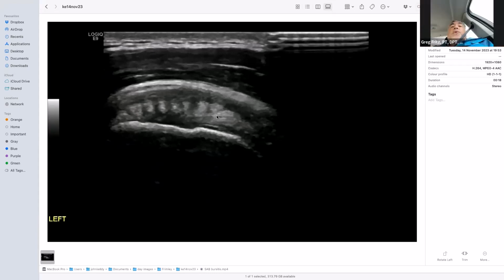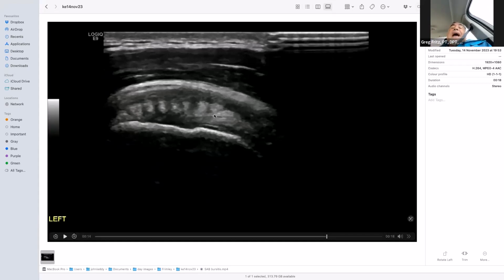When you do the reps that John Leddy does, I have no problem encountering even academics in what they tear down in a single cadaver to be evidence that this is it. Another question for me while you're on this anyway. When it flattens out like this, we've historically called that the middle facet, as opposed to the superior facet of the three facets on the humeral greater tubercle. Do you give any credence to that?